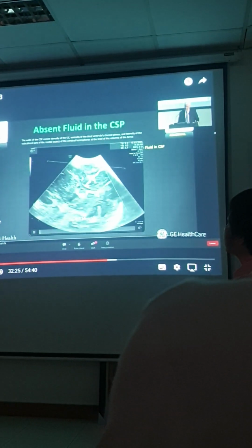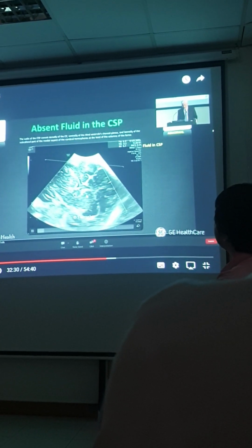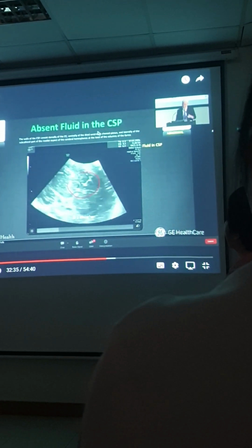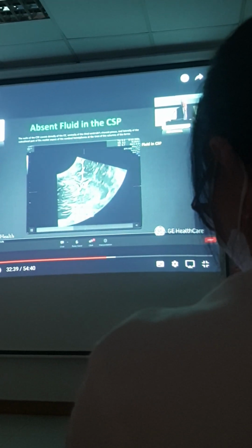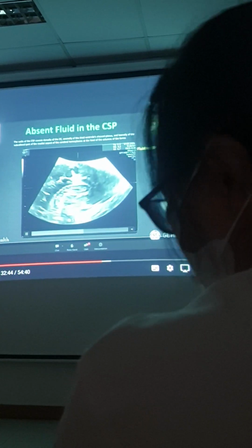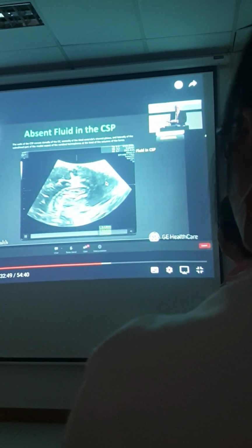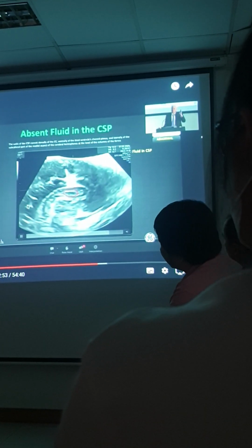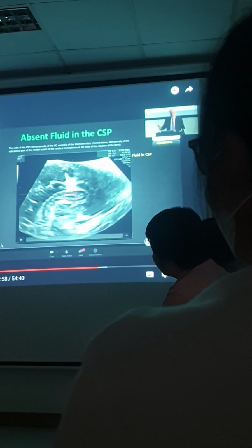And then just to mention this scenario, in fetal axial images we could not see the CSP, we go on to coronal images, we could not see it in the septum. And this is not that the CSP is absent, it's that the fluid inside it is absent. And again, by transvaginal high resolution 3D with VCI, we can actually see that there is fluid in the cavum septum. A situation which you are far more likely to be faced with in the third trimester, because we know that the CSP forms, is visible in most by 17 weeks of gestation and starts to disappear in some.